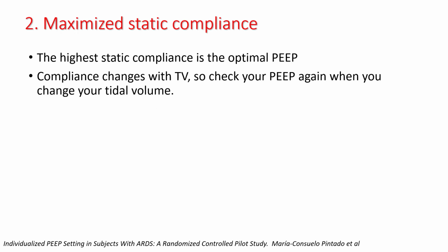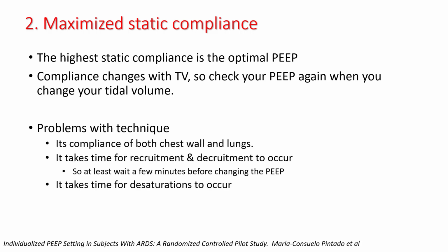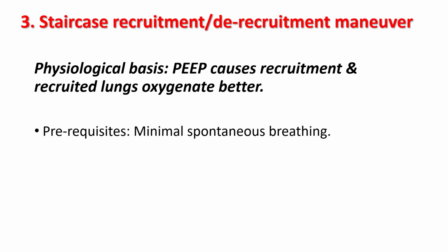One of the things you have to remember is that when you change the tidal volume of the patient, you have to redo everything and you have to check your PEEP again for that tidal volume. There are a few problems with the technique. It takes time for the recruitment and de-recruitment to occur. At least wait a few minutes before changing the PEEP.